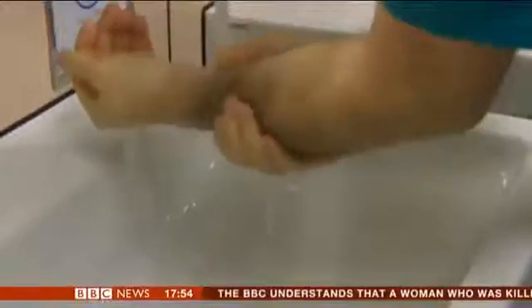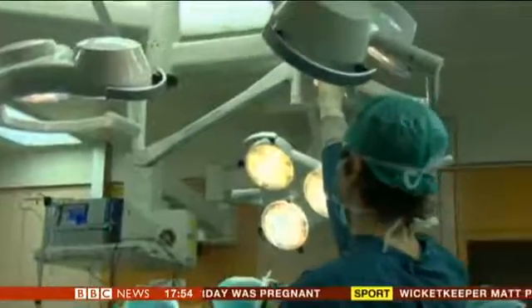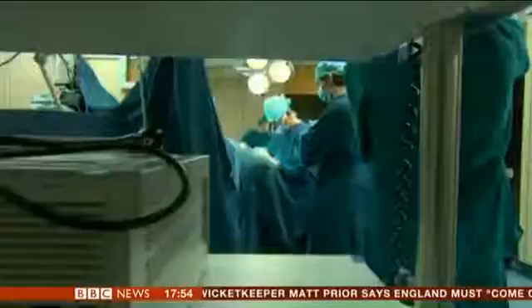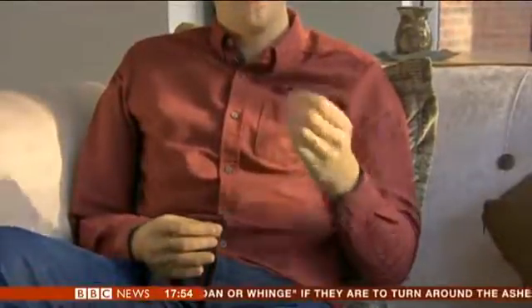What this means is that we take all the nerves that originally went to his arm and reroute them into muscles of his chest, so that eventually when he thinks of moving his hand, moving his arm, moving his fingers, the different muscles on his chest wall will then start to fire. Part of the muscle that they've put it in, my hand actually feels as if it's on my chest, so now when I tap the left-hand side of my chest, it's my thumb, when I tap the right-hand side, it's my actual little finger. So now when I think about opening my hand, which is, I think about doing that on this side, it actually, if we get there, opens the hand.